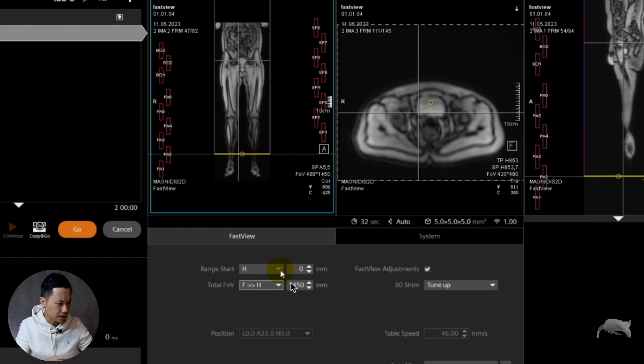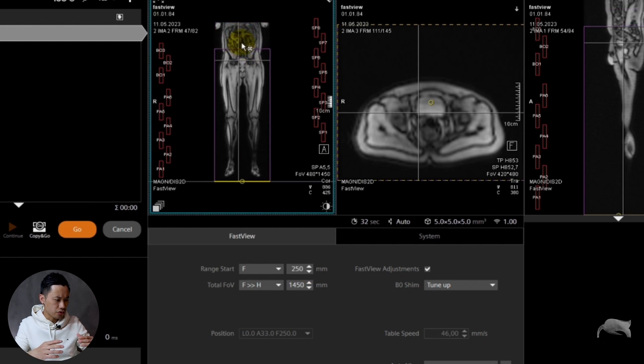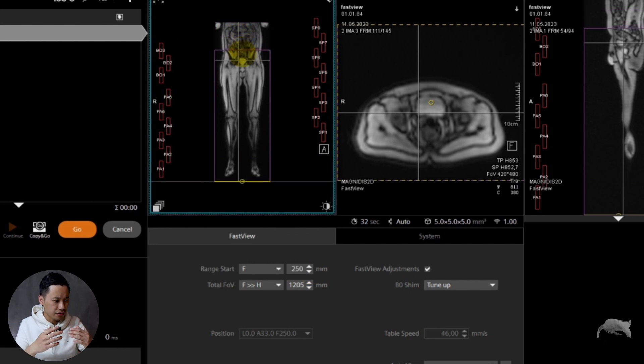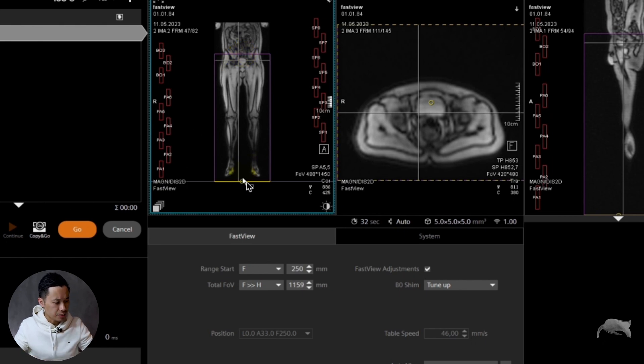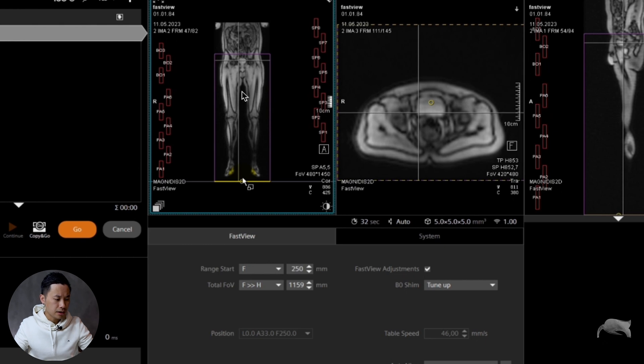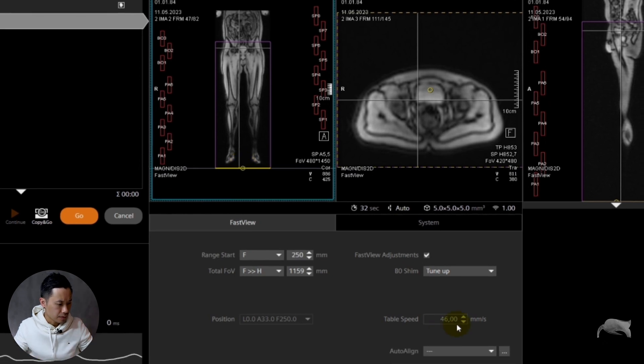You can see here now I have the opportunity to drag my area of interest lower or higher and save the protocol like that. So I know each time whenever I'm starting my localizer, I would have from here to here. It also depends on the patient, of course.